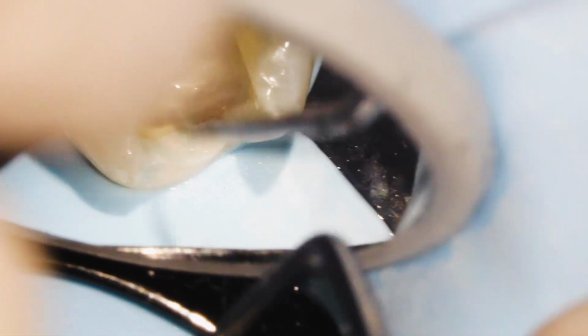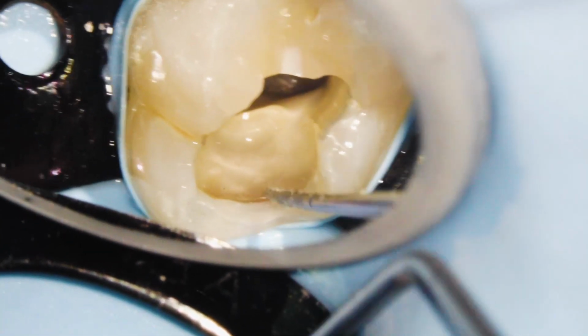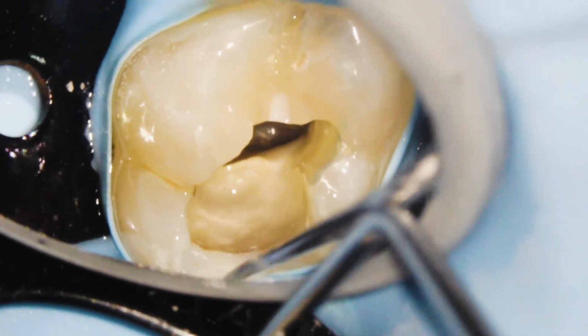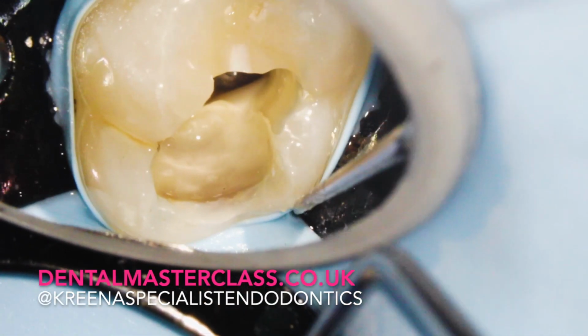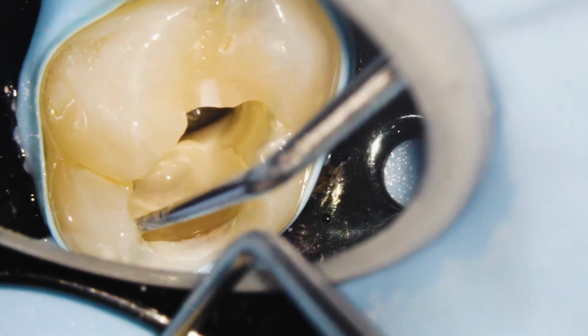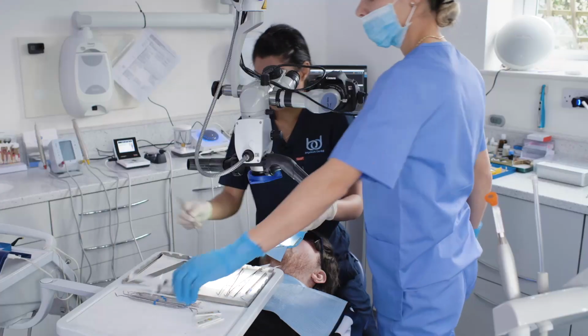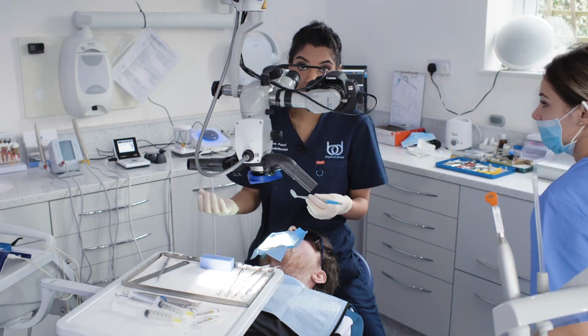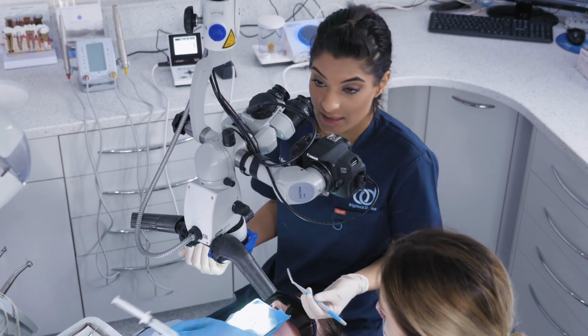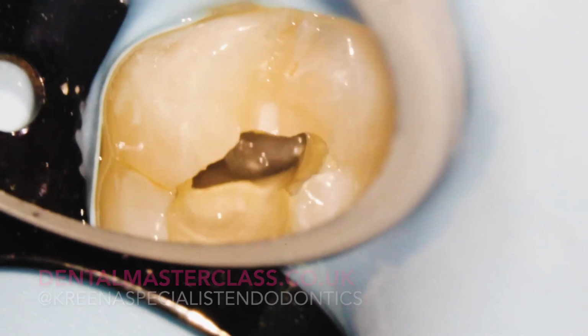So we're quite lucky in this case because we've got 4 walls, so this distal wall hasn't really been compromised. But normally if it has, so we've got a DO restoration here, I would tend to rebuild this back wall up with composite. So I would put on a matrix band, put a little bit of Cavit or any sort of temporary material that can be sealed out into the pulp chamber, and then rebuild that back wall up in composite or GIC, and that would give us 4 walls, so that basically you get a pool of irrigant on the inside when we do root canal treatment.